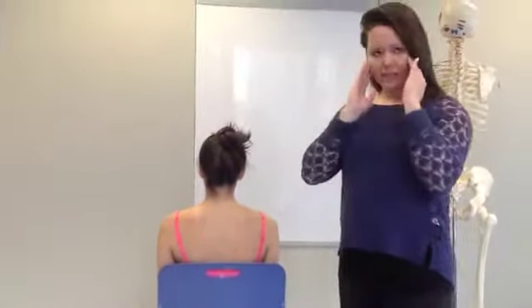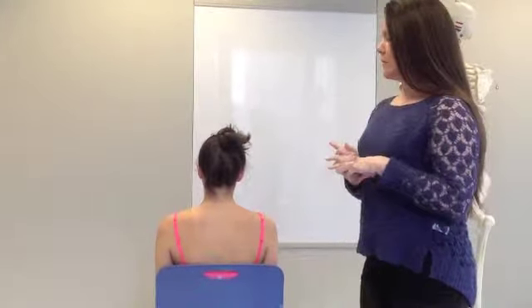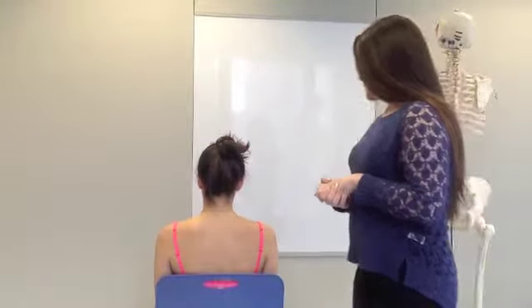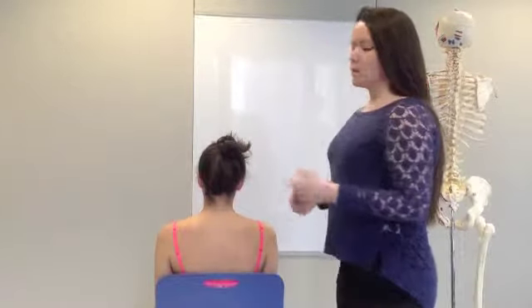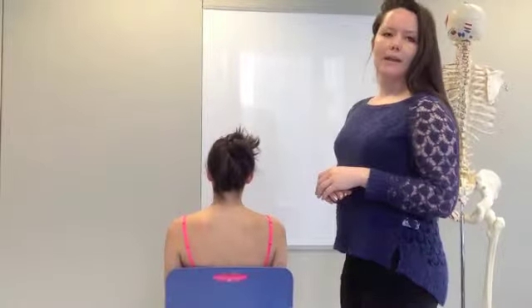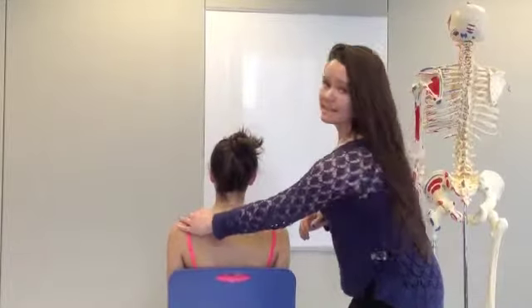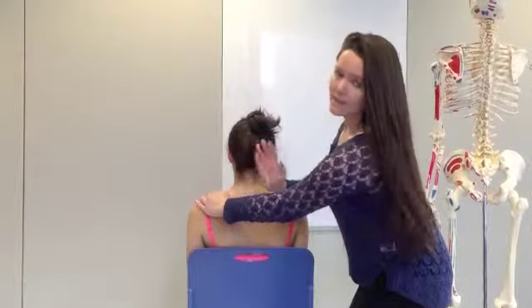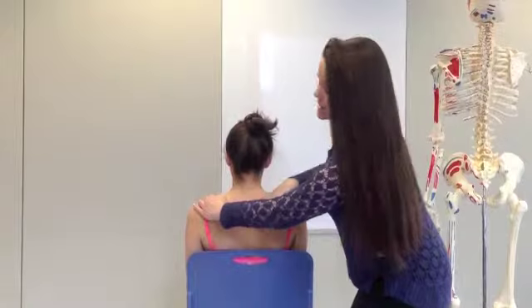So you don't want any flexion or extension of the head or any rotation going on as well, so that we know that it's a pure side bending motion that we're observing. In order to help make sure that this is the case, initially before we even pick up the goniometer, we're going to talk to Kelsey about how she's going to move her head and instruct her. We'll do this by stabilizing the same side shoulder to make sure that there isn't any rise or flexion in the shoulder girdle or in the thoracic spine.